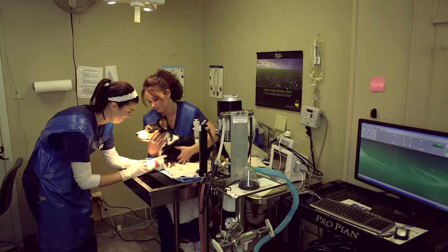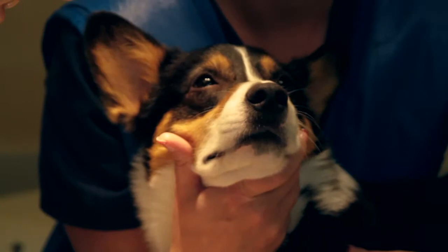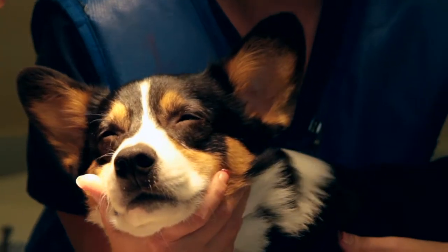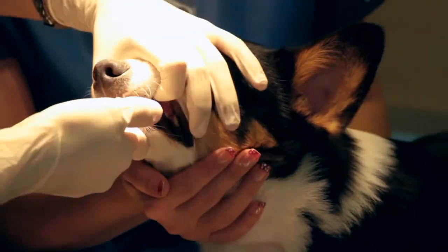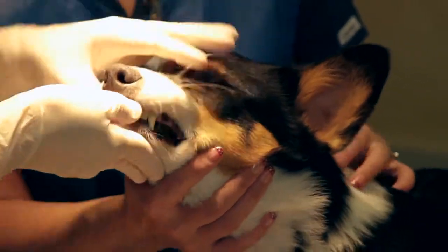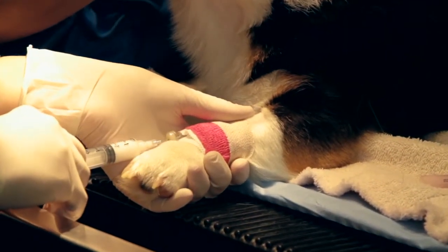And SNAP's feeling really good right now. We've asked SNAP to start counting from 100 backwards, and we didn't make it very far. I think SNAP made it to about 91, and it got very blurred after that. So now Miss Chiquita is going to check to see if we're ready for induction. Not yet. We saw a little swallow there and a little bit of resistance.